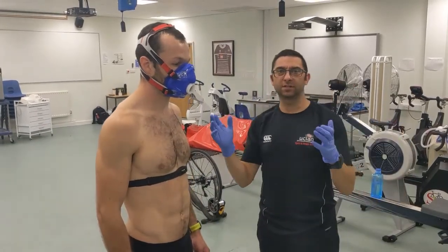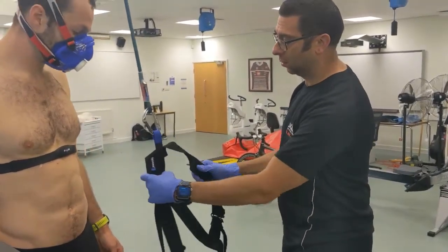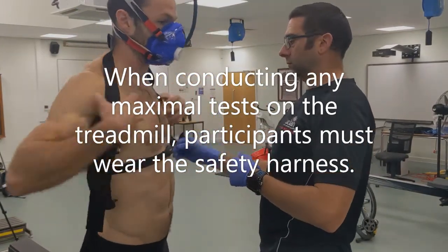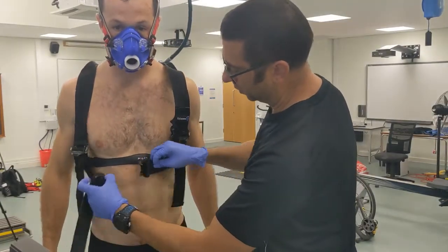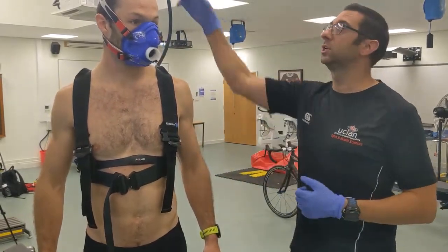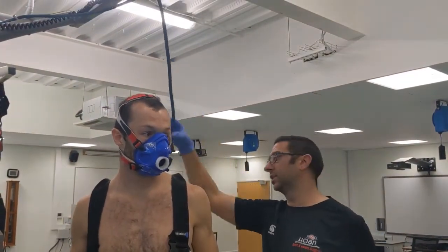The mask is set up. Next, we're going to use the harness, so step into that and it buckles around the waist like that. You don't want it too tight because that would prevent natural movement — you want a little bit of play in the safety cord. That's fine.